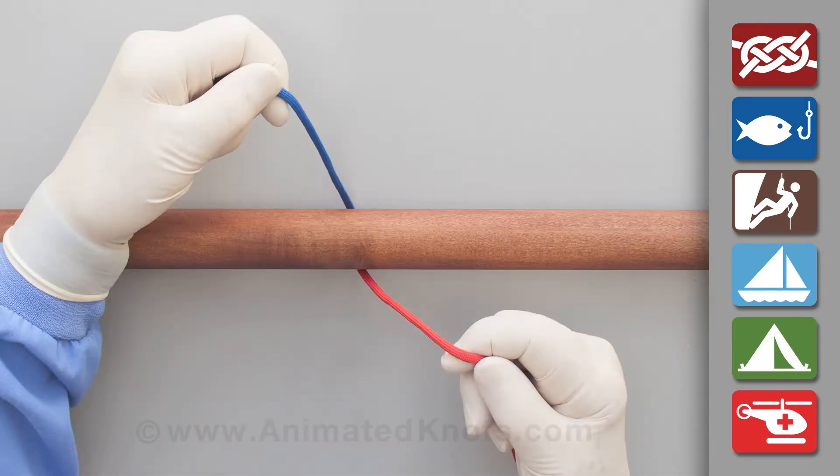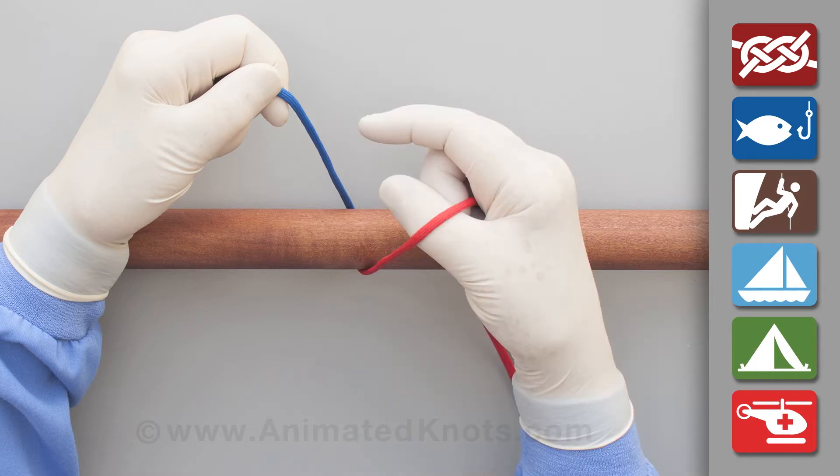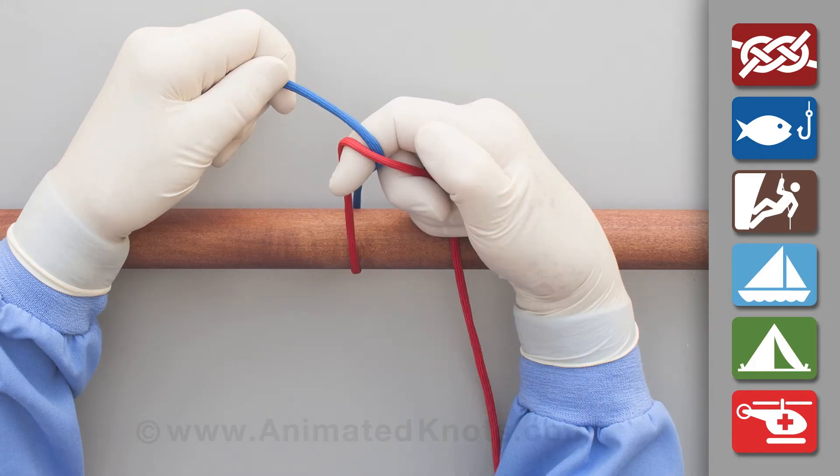Hold the short end in your left hand and keep the long end in the palm of your right hand. Insert your right index finger between the two ends so that they cross in opposite directions.